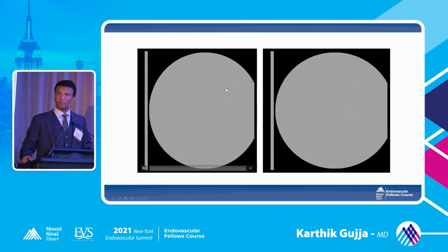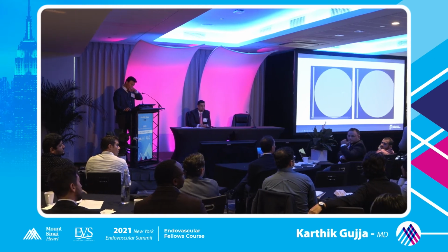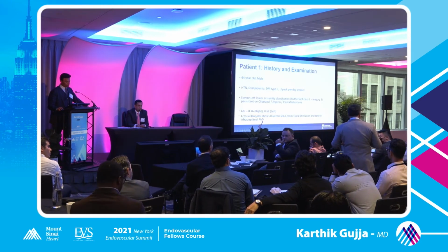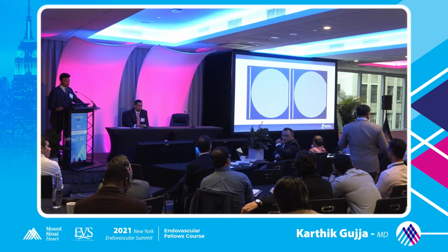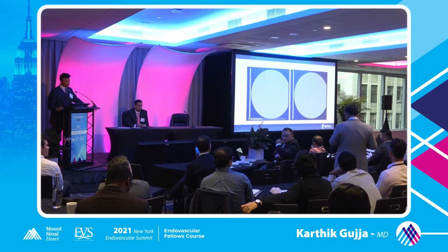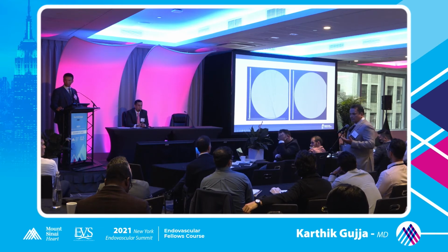Right. Just for the fellows, the filter use is very controversial, because if you ask a lot of very talented operators around the country, they'll tell you don't use filters because they don't use filters. But I think what's important for all of you to remember is that it's the time that you spend on the case and how you're going to bail yourself out. So if you believe there's a high risk of embolization, either in the morphology of the plaque when you cross the lesion, or in the nature of the presentation. If the patient presented with, say, subacute symptoms, 2 to 3 weeks, maybe a thrombotic event occurred that probably narrowed it and there's underlying thrombus, so you might embolize. So it's very important because the cost is important.